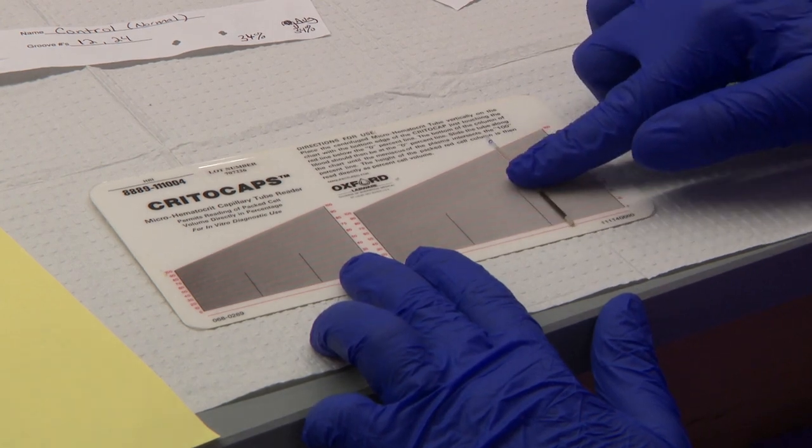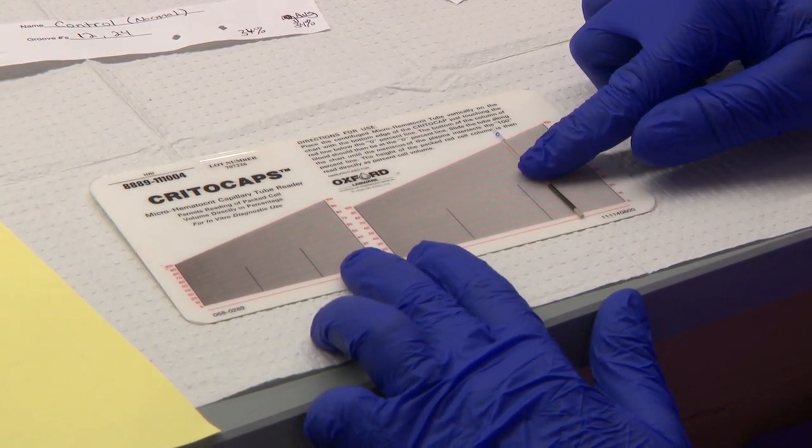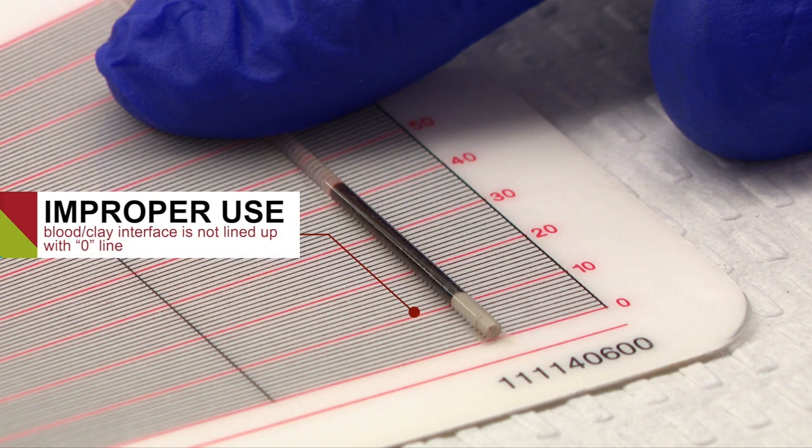If the control is not within the acceptable limits, first check that you are using the hematocrit reader properly. If the hematocrit control is still not within acceptable range, testing must be repeated.